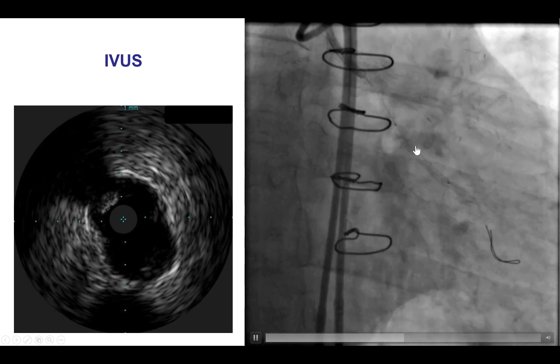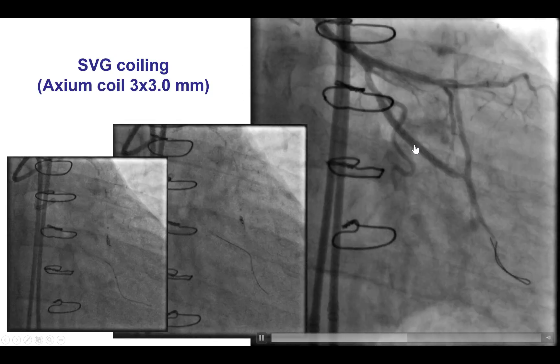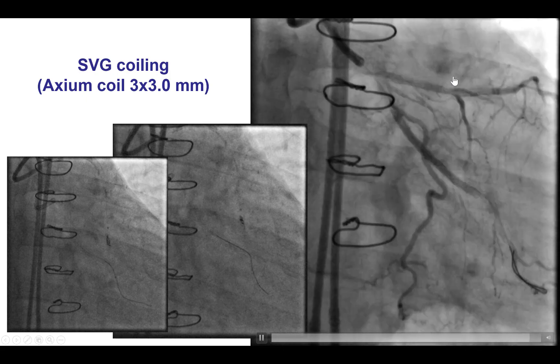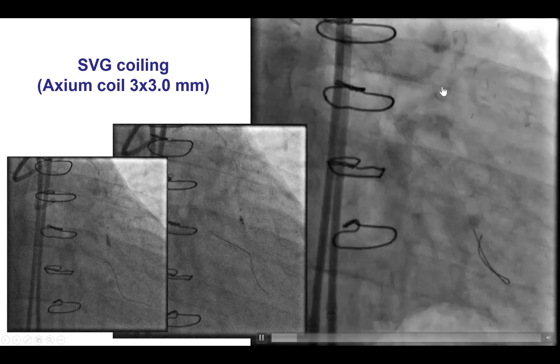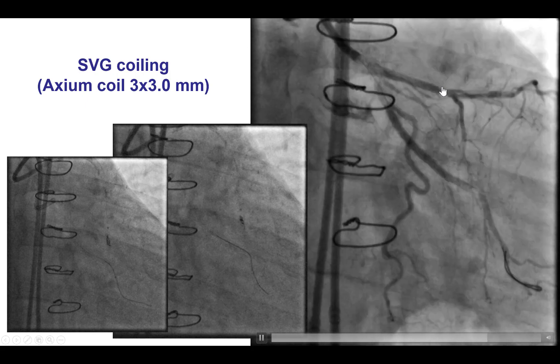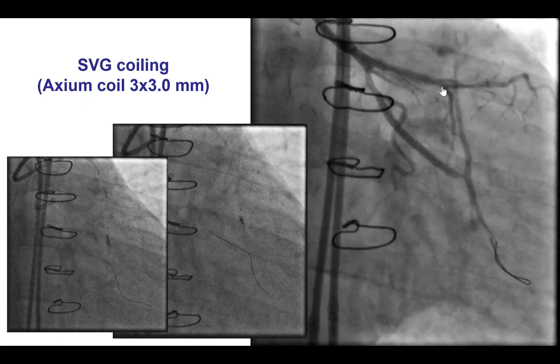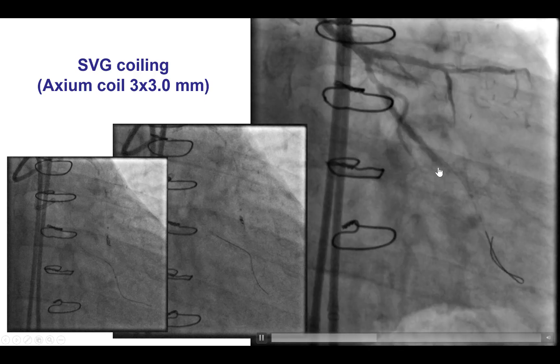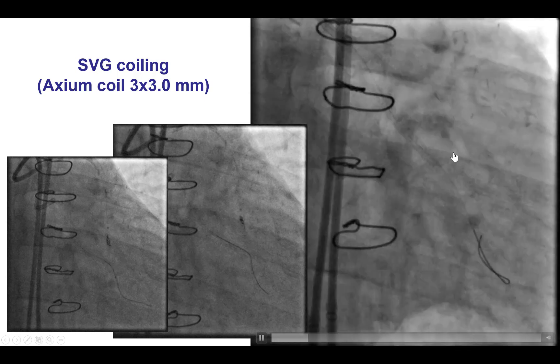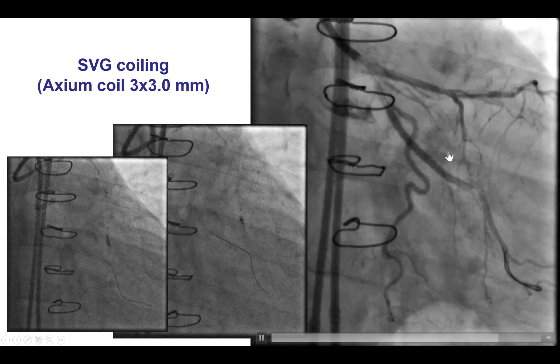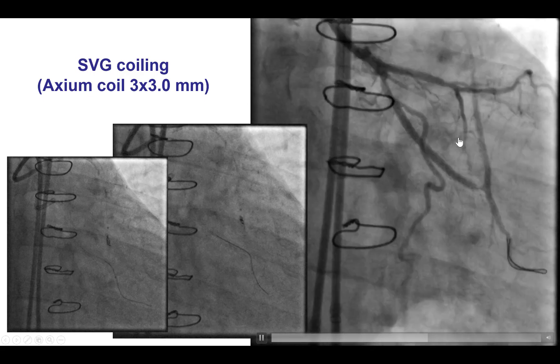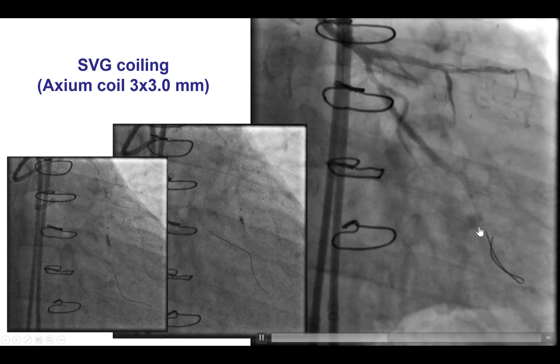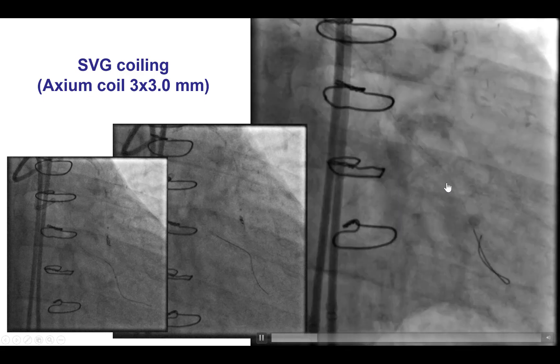The question was then what to do with the saphenous vein graft. It is tricky when there are saphenous vein grafts like this one that have fairly brisk competitive flow. The reason being that this may lead to thrombosis of the recently placed stent. Many operators suggest that these vein grafts are coiled after the native coronary is re-canalized to prevent competitive flow and reduce the risk for thrombosis of these new stents.